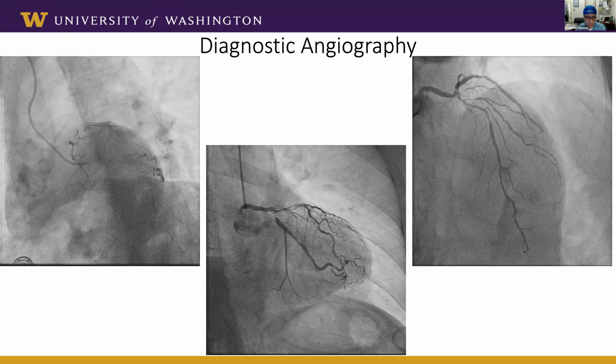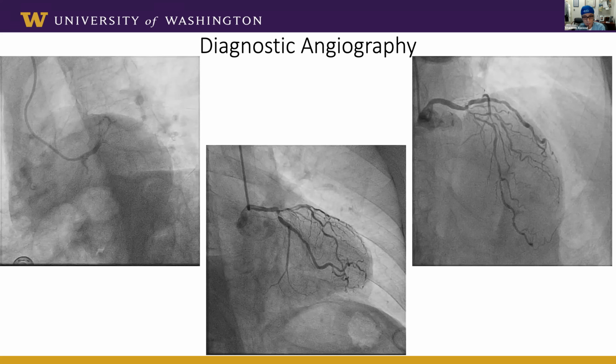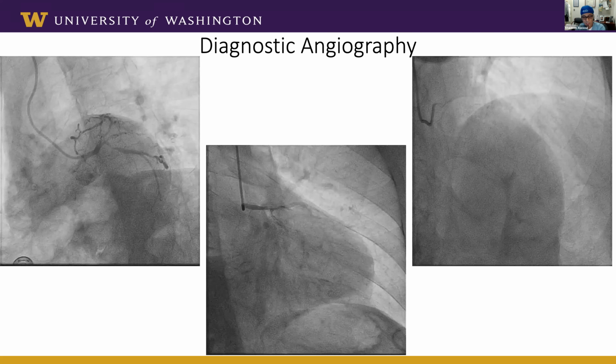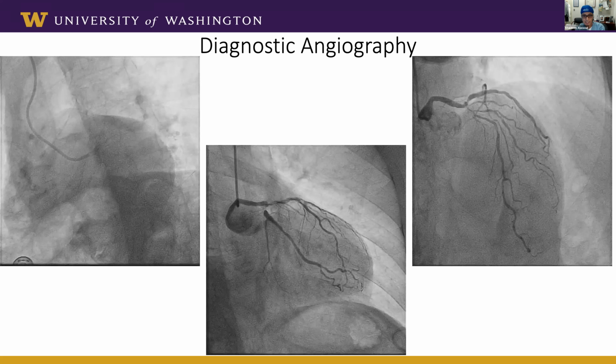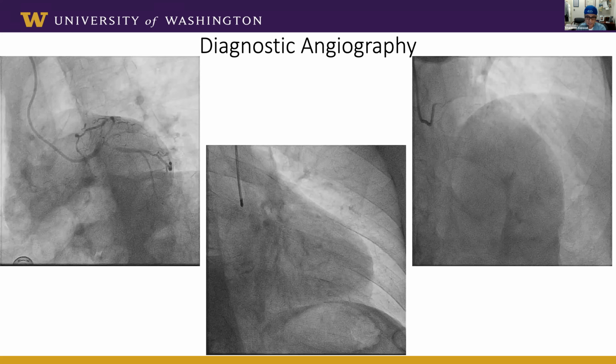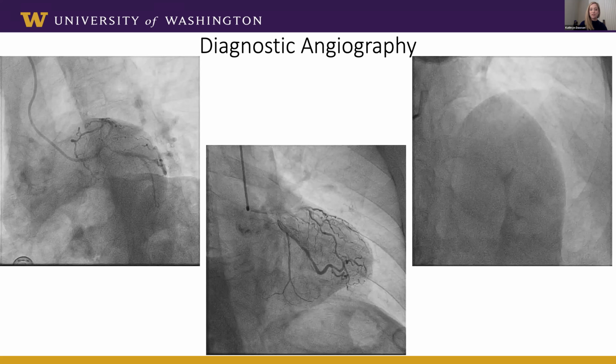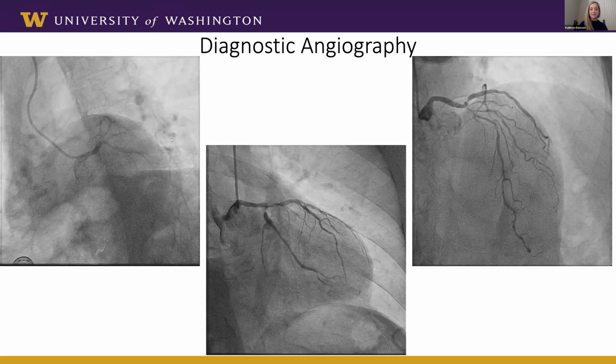I can't wait until we have the Agent balloon, which is a drug-coated balloon. This could be a good strategy here, where you can use a drug-coated balloon in a diagonal, a drug-coated balloon in the ramus, and you do bifurcation stenting for the rest. Yes, we talk about how we anxiously await the drug-coated balloons on an almost daily basis.